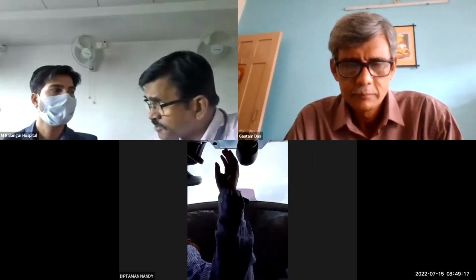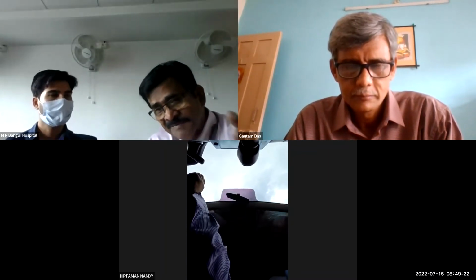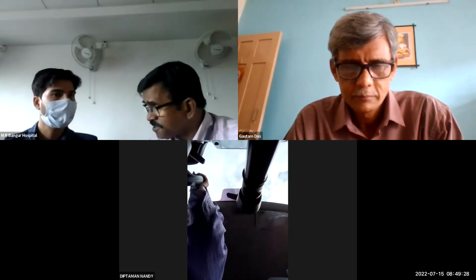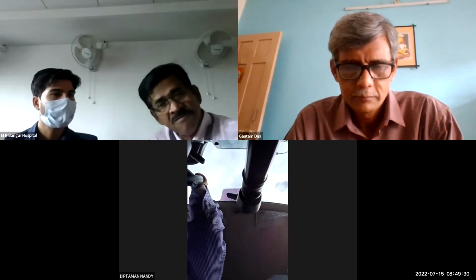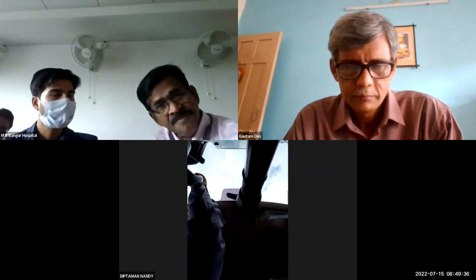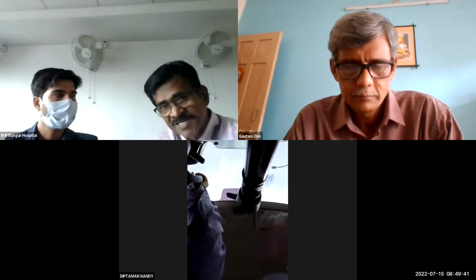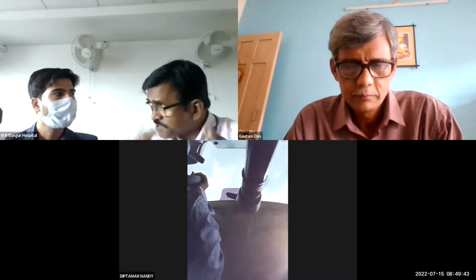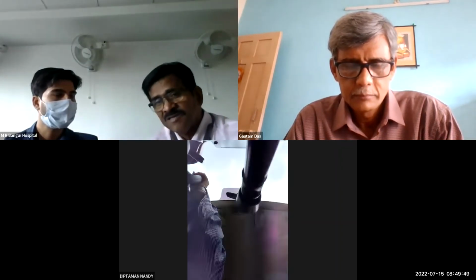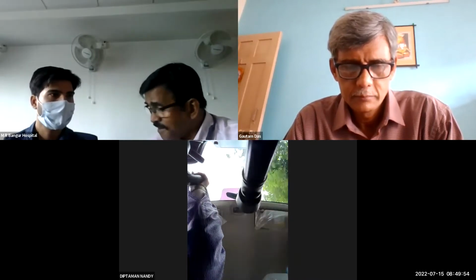Carbon dioxide is a highly diffusible gas. Once you insert carbon dioxide into the peritoneal cavity, it gets absorbed. And this carbon dioxide in blood does not cause embolization because it is water soluble. It gets combined with water and forms carbonic acid. That goes to the pulmonary bed and splits into water and carbon dioxide. You will often find that the anesthetist is hyperventilating to wash off this carbon dioxide. If this carbon dioxide remains in circulation, this hypercarbia can cause different types of cardiac arrhythmias, including asystole.